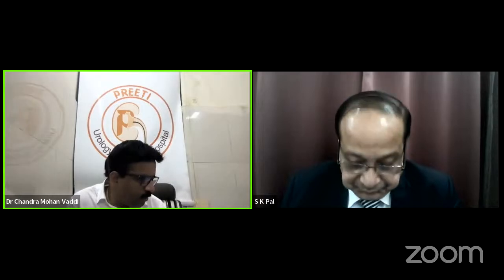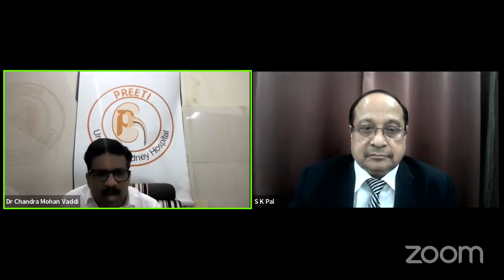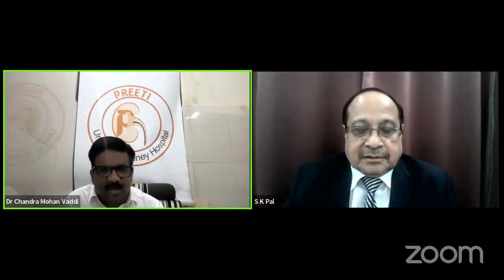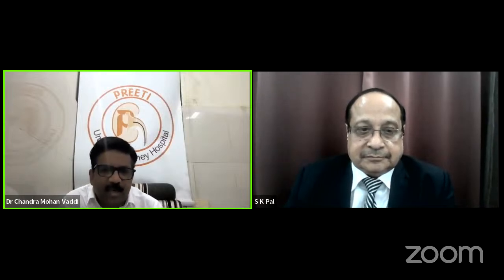Last two questions. Wasim Ashraf again asked: does an irrigation pump, simply an irrigation bottle with a discarded pump of a sphygmomanometer, help in improving vision in miniperc, which is a problem despite its advantages? Ultimately, is raising the pressure with the nephroscope itself doing the procedure better with miniperc, or is it doing the wrong thing? PCNL is known for low pressure.